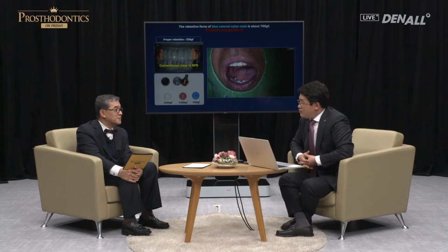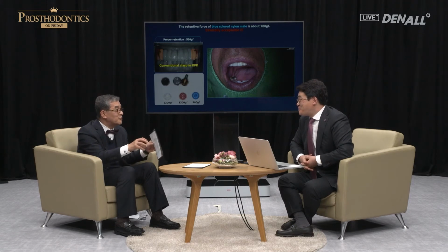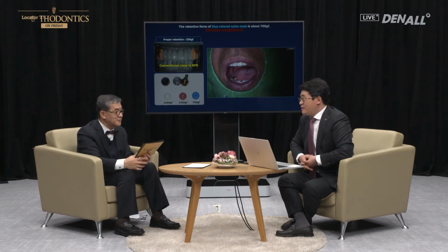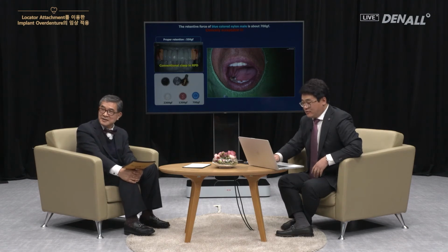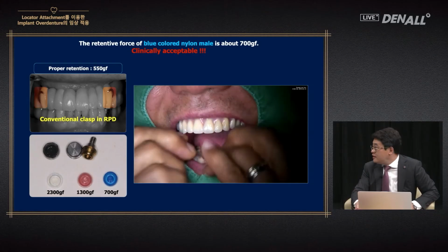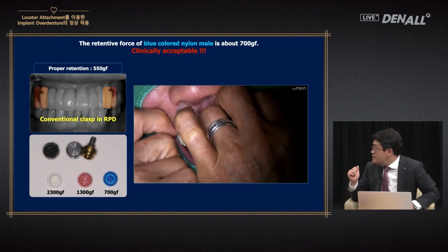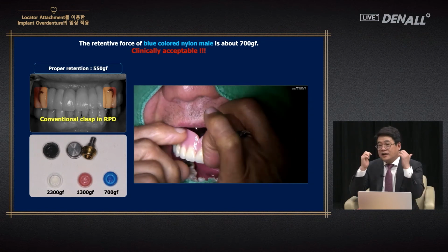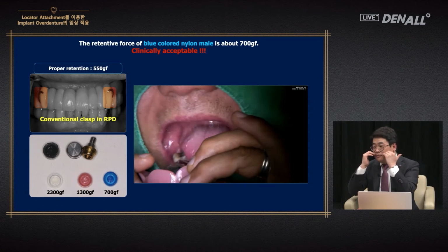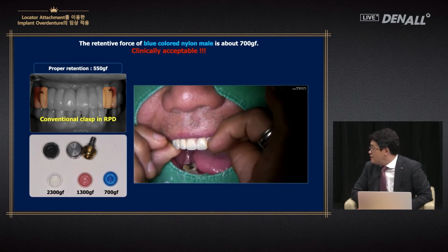Clinically, the white is piling up, and I'm lacking in blue. I hope the vendor provides more blue. You cannot order just blue, you have to order in sets, so the white is piling up. It's quite strong. As you can see, this is a male patient, and the patient is struggling to get it out even though it is blue. It is quite difficult. Therefore, I make a ring or notch so that the patient can use it with more ease.